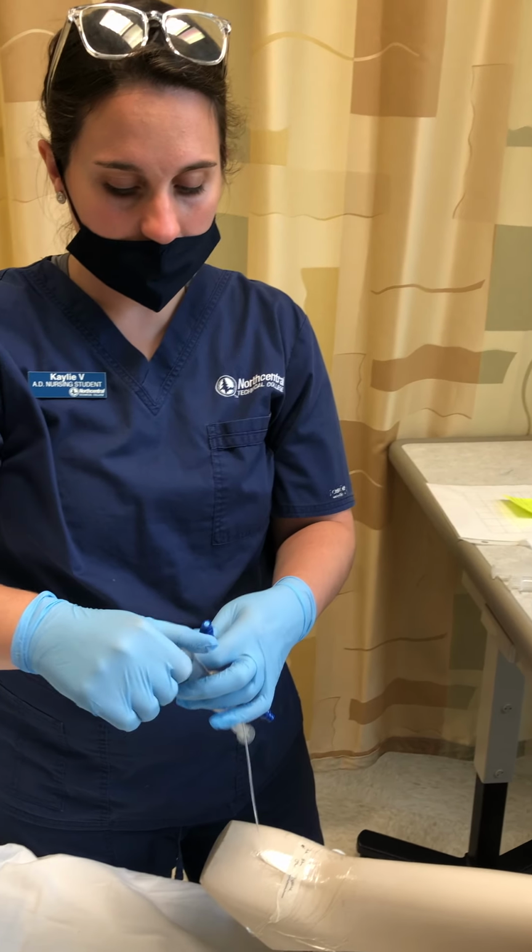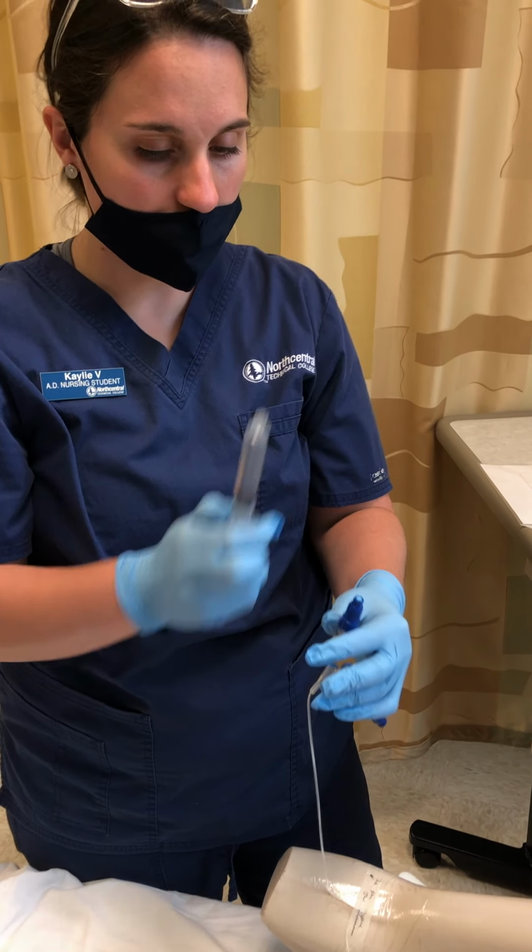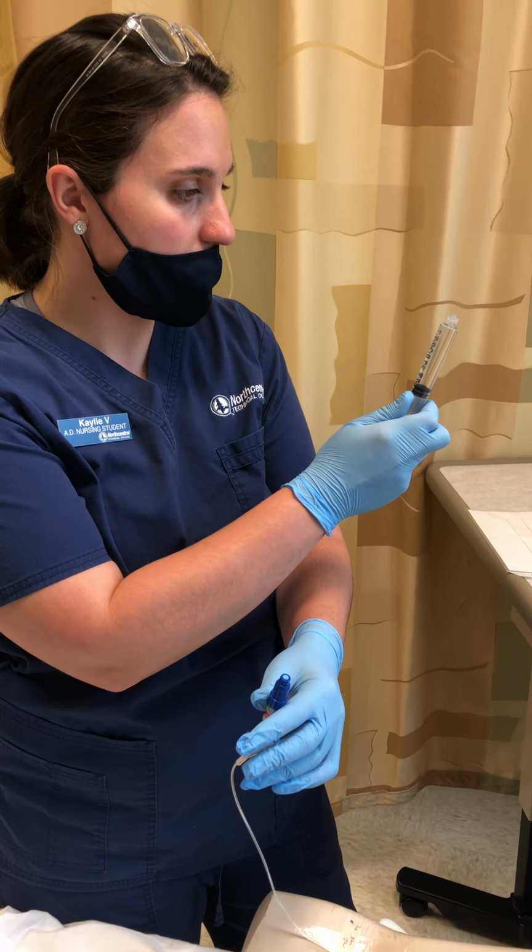And then I'm going to administer an IV flush of 5 to 10 mLs at the same rate that I administered the medication, so over 1 minute.